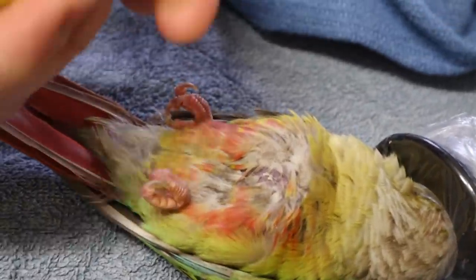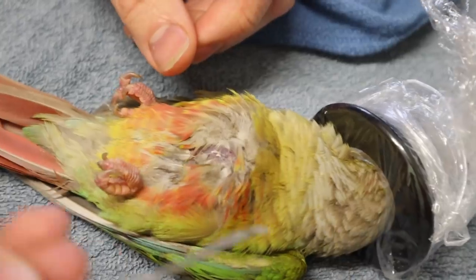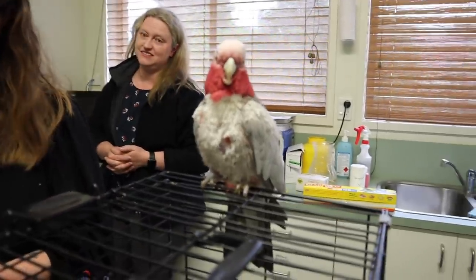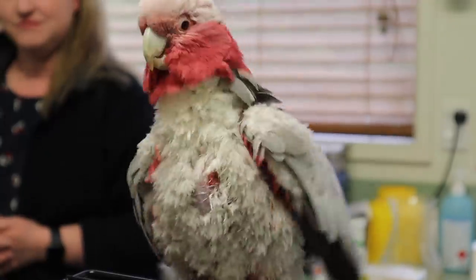Today we got special permission to actually videotape this procedure being done. You can put your bird under for this, say if you're doing a full exam and maybe it's going to be kind of traumatic, or you can choose not to because really what's going in is just this tiny little microchip, which is about the size of a grain of rice, going into the chest muscle. I want to clarify a few things about the microchip before we get started and you guys get to see what this looks like.